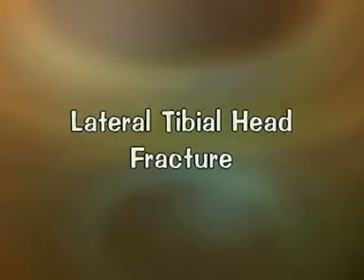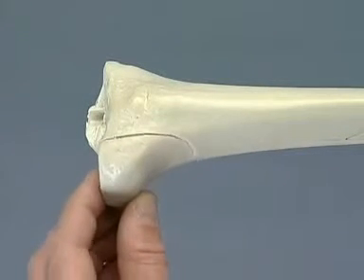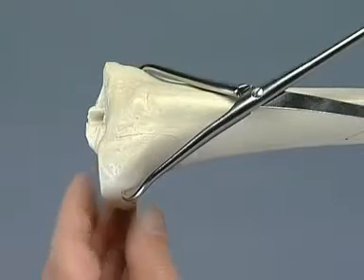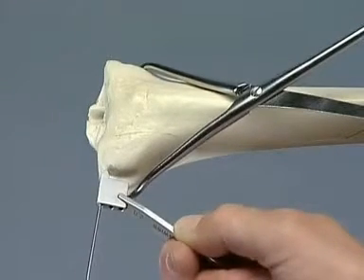Lateral tibial head fracture. Reduce the fragment and fix it with a pointed reduction forceps. Insert a K-wire for preliminary fixation.